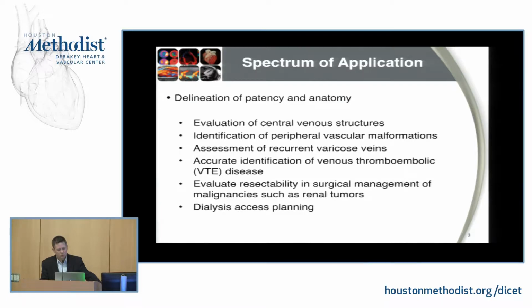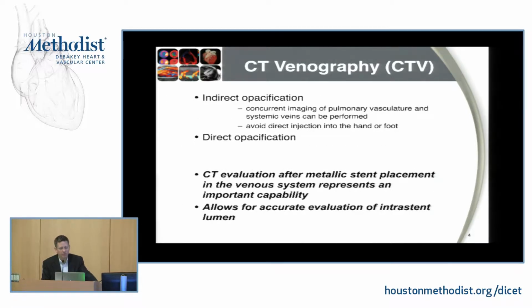And in the venous structures, we've got a few things that are a little different, right? We're looking for venous insufficiency or the improper movement of flow. We don't usually think about that on the peripheral arterial side at all. Obviously in the heart you are, but in the venous system that does mimic that because of the valvular function. Whether or not we can operate, whether or not we should operate, and whether or not the procedures we're doing are working out. So both benign and malignant disease are implications for the evaluation.